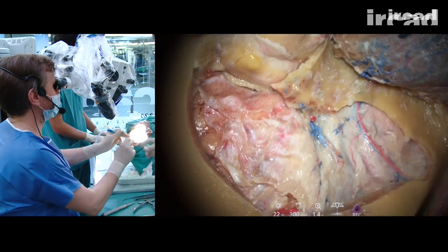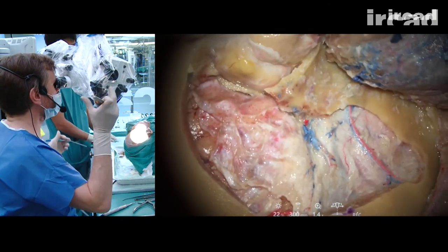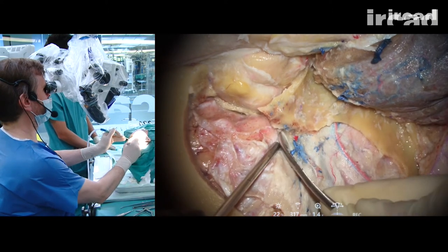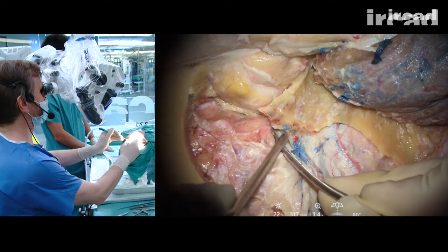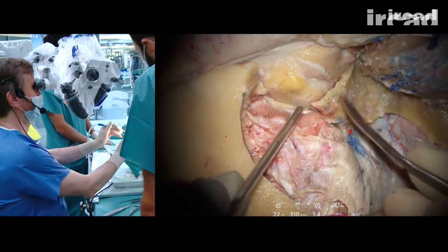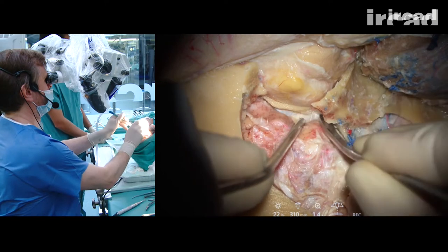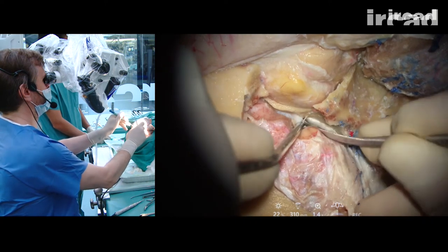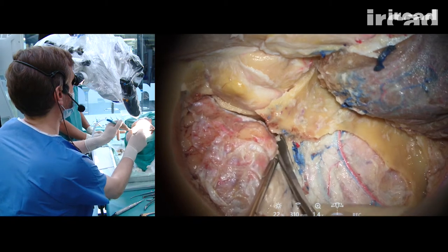So now we can start with the extradural work. What we want to remove now is this pyramid of bone made by the greater and lesser sphenoid ridge. So we peel the dura mater away from the superior wall of the orbit here, from the superior aspect of the sphenoid ridge. The sphenoid ridge is here.